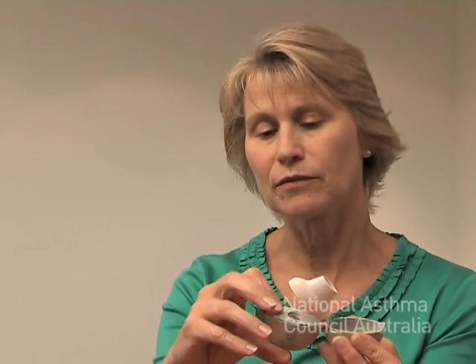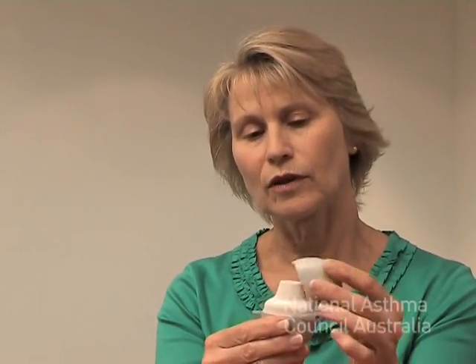If you do need to clean it, which is recommended about once a month when you get your new prescription of capsules, just open it all up including the base and run it under warm water. It generally cleans out any powder or residue that's in the compartment. Leave it open like that to air dry. Once it's completely dry, close it all up again.